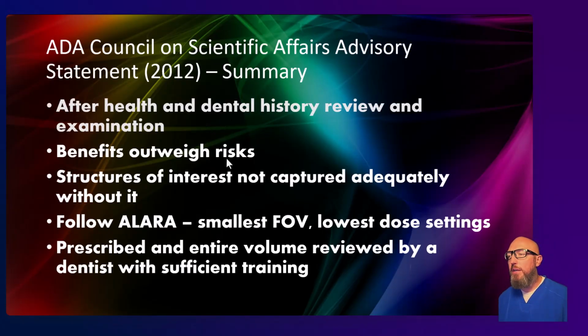It's always after dental and health history review and examination. Make sure the benefits outweigh the risks. Structures of interest are not going to be adequately captured with just 2D imaging. Always follow ALARA principles, meaning smallest field of view, lowest dose settings that you can get away with. And then it should always be prescribed and the entire volume reviewed by a licensed dentist and someone with sufficient training to review the volume.